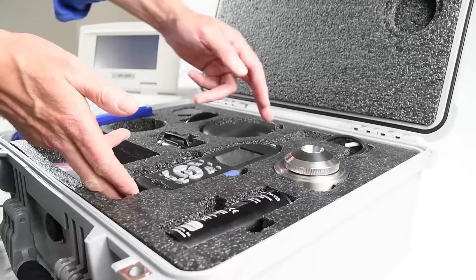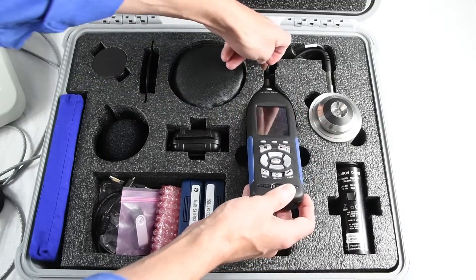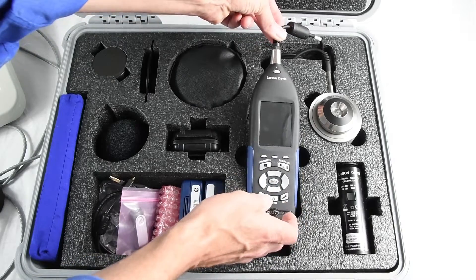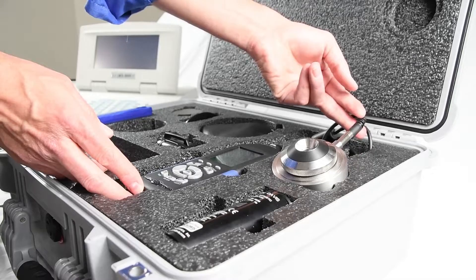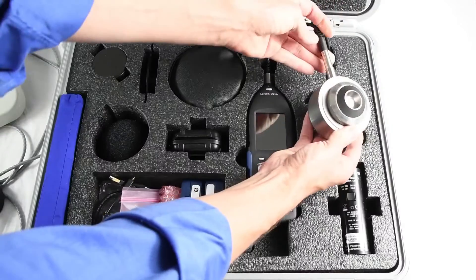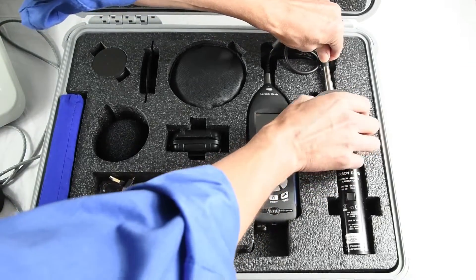It all starts with the SoundAdvisor model 831C sound level meter with OddCal firmware. A microphone cable connects the meter to the PRM831 preamplifier and then into the AEC-201 artificial ear coupler with the installed 377C13 half-inch pre-polarized pressure microphone.